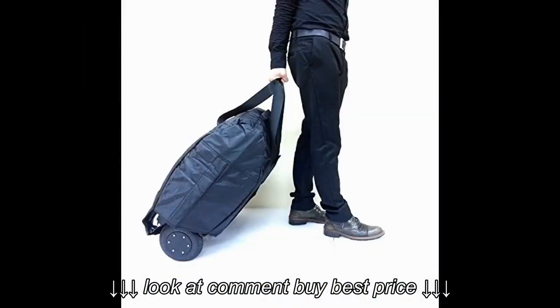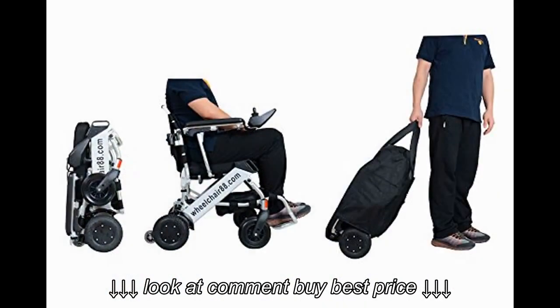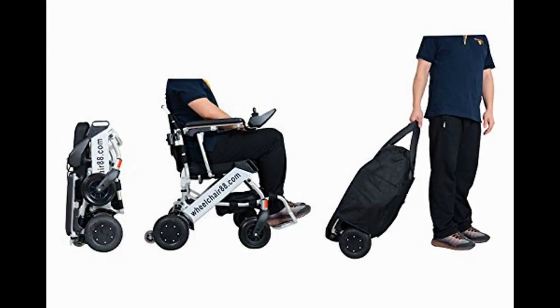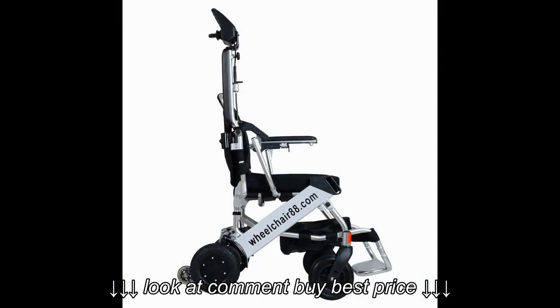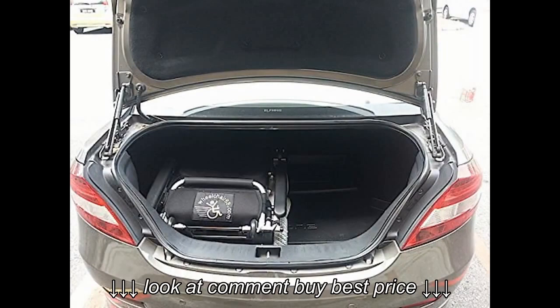We looked at other foldable chairs and scooters before stumbling across this. This chair is the lightest we have found by about 50 pounds, and folds up to fit in either the back seat of the car or the trunk. Unlike most portable scooters or chairs, it doesn't come apart into four pieces, so I don't have to worry about parts of it missing when traveling by air. It's even more compact than her regular transfer chair.